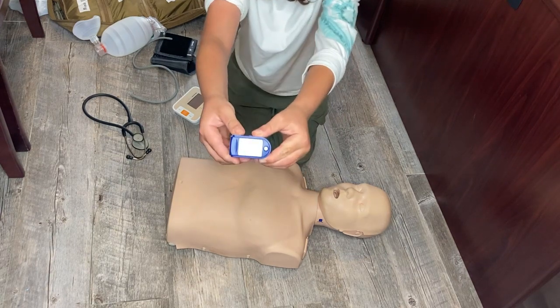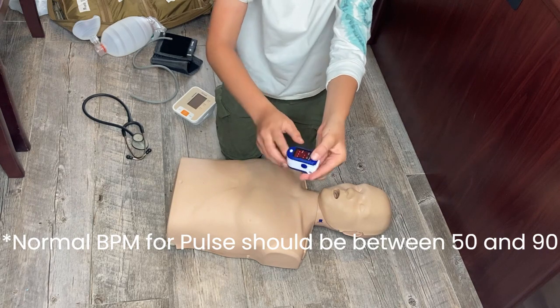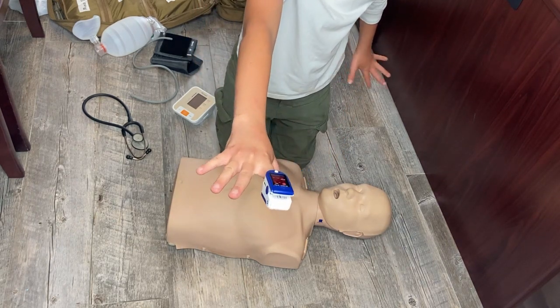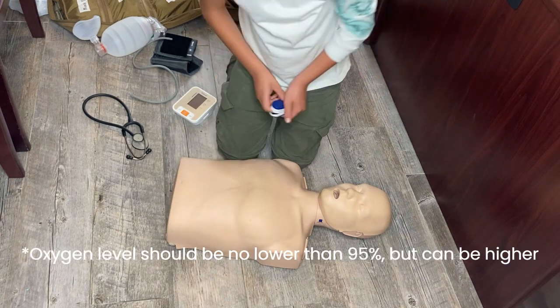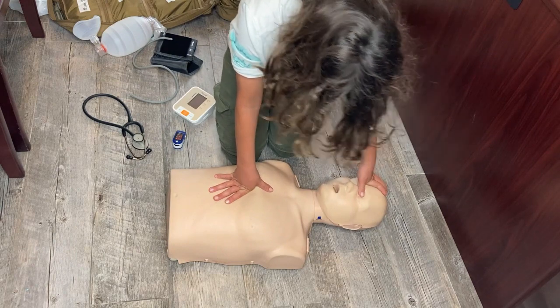Now we're going to talk about the pulse oximeter. You click the button to turn on the pulse oximeter, and then put it on your finger just like that and stand still. And that is our basic life support for CPR and vitals.